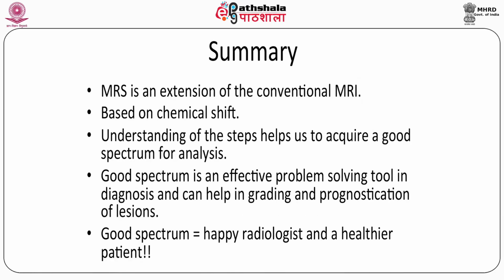So, in summary, MRS is an extension of conventional MRI. It supplements MRI in various aspects. It is based on chemical shift effect. Understanding the various steps helps us acquire a good spectrum for analysis. A good spectrum is an effective problem solving tool in the diagnosis and can help in grading and prognostication of lesions. A good spectrum leads to a happy radiologist and a very healthy patient.